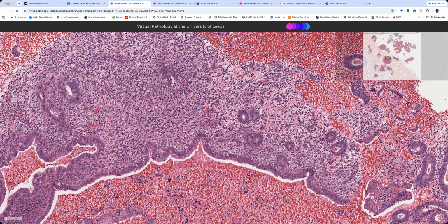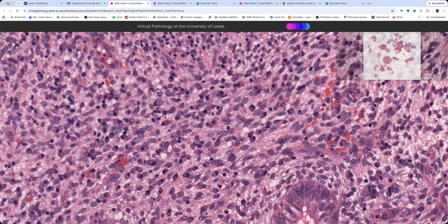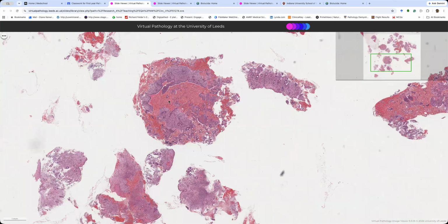The big pitfall is you've got tuboendometrial metaplasia in the cervix, and the cervix is full of normal plasma cells. So you can't tell whether it's endometritis if there's tuboendometrial metaplasia, like there's tubal metaplasia, unless there's really good endometrial stroma as well. So just seeing something with plasma cells and some dark glands that aren't typically those cervical mucinous glands, just think for a moment, is the stroma right? Is this, in fact, a bit of cervix that I've got hold of? But no. Okay.